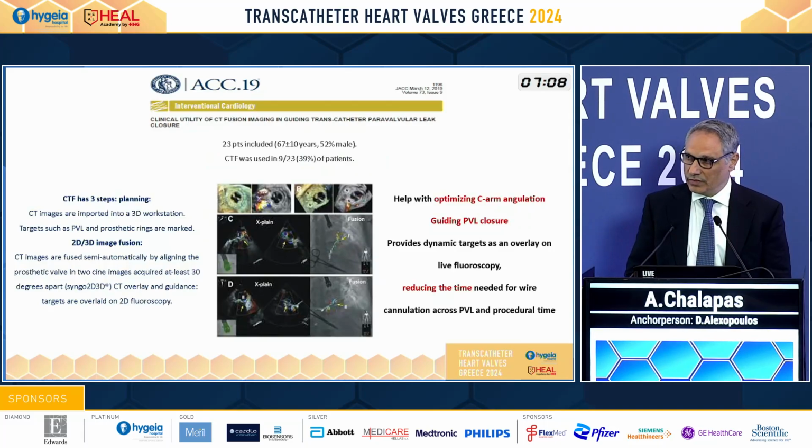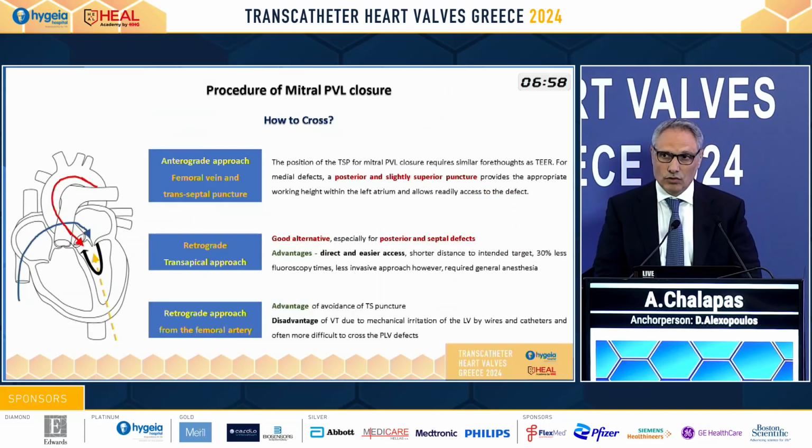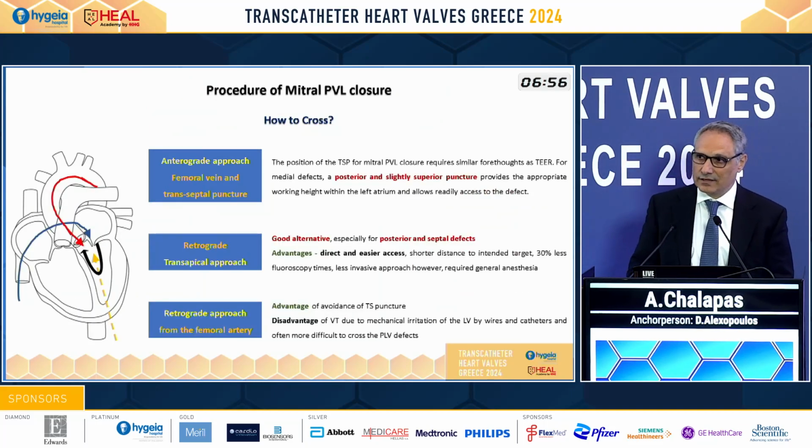Fusion techniques can also be used. They can provide us dynamic information during the procedure for the better and correct wiring and implantation of the devices. And regarding the access site in case of paramitral defects, we always have to think first of the antegrade approach through the septum.